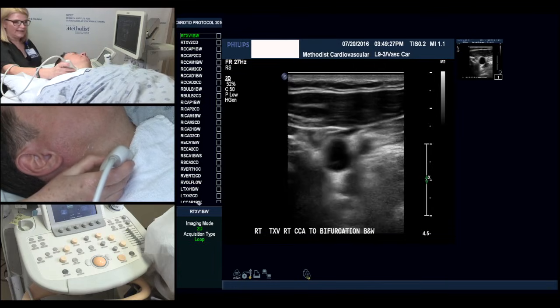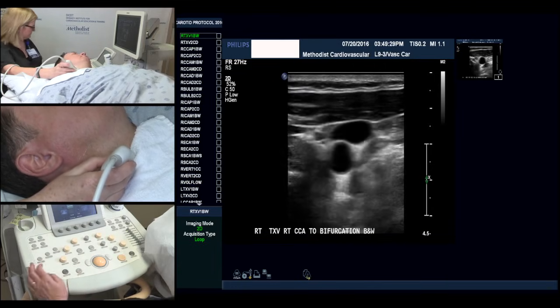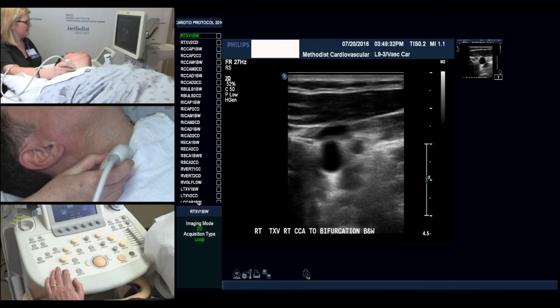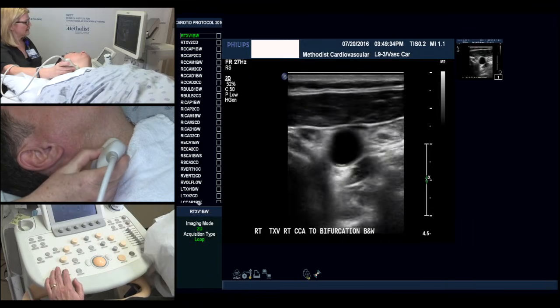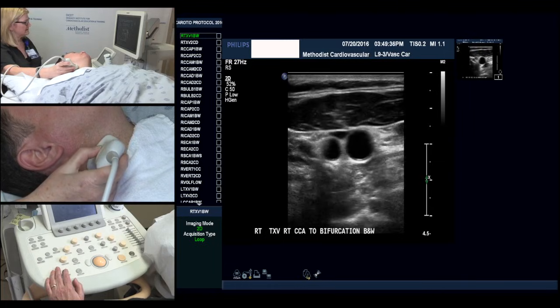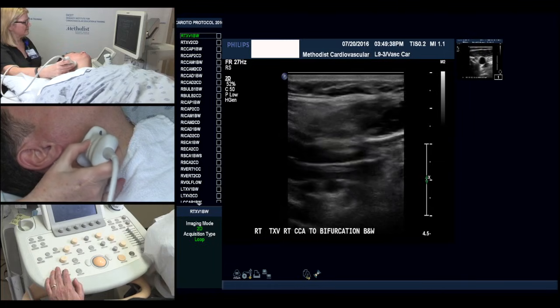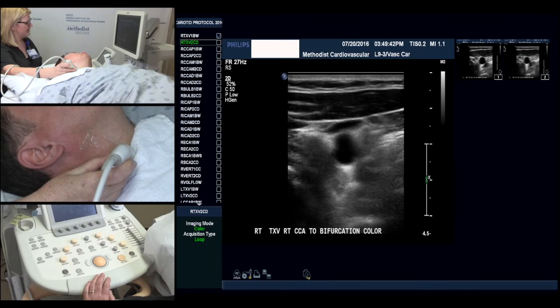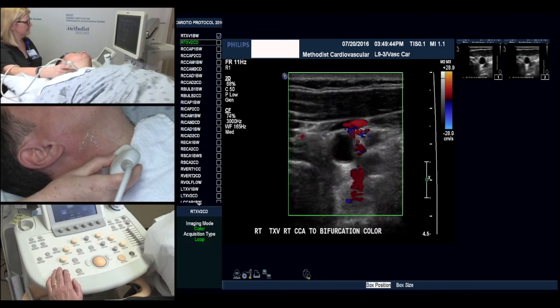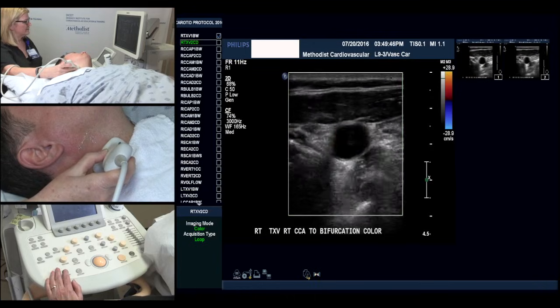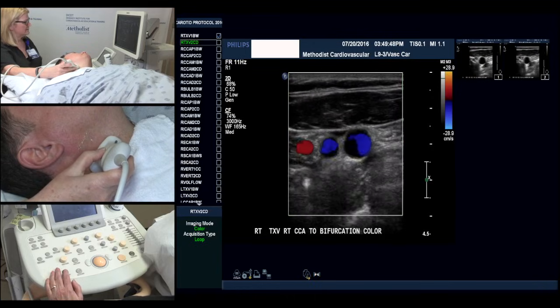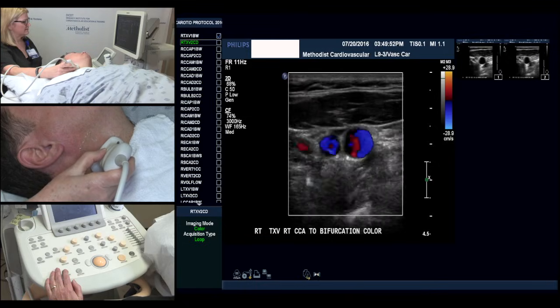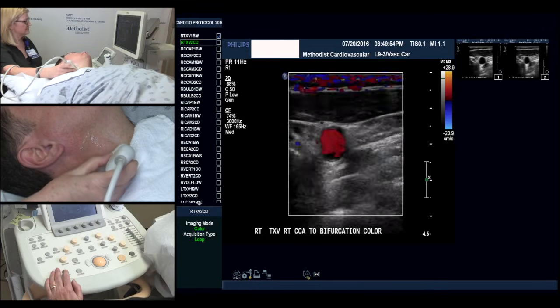We start by positioning the head and let's start the protocol. We start in a transverse approach. We capture a live segment and follow it to the bifurcation, come back and then we repeat this with color. Again, sweeping up slowly, we see the split of the internal and external and we're verifying that there's color flow in each of the vessels.